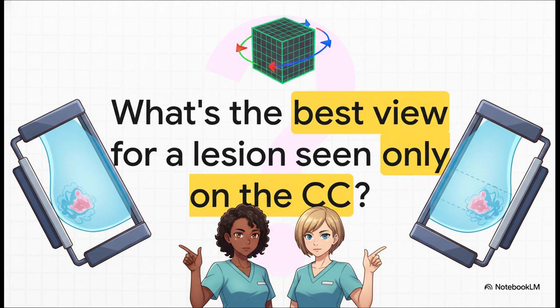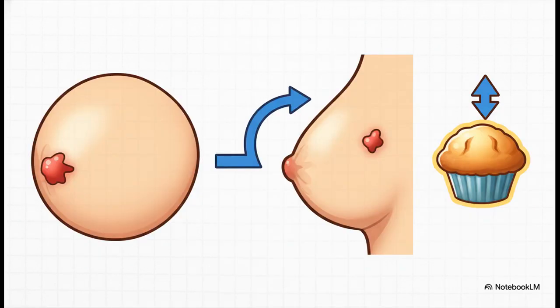Okay, round 2. The radiologist sees a potential lesion on that top-down CC view, but it's completely vanished on the angled MLO view. How on earth do you figure out where it is in 3D space? That's when you call for a true lateral, or ML view, which is a straight-on side view.